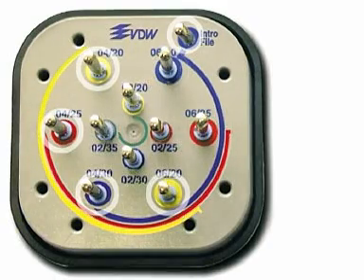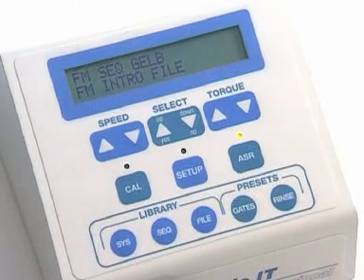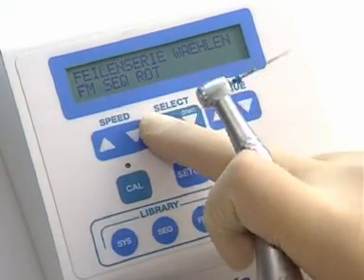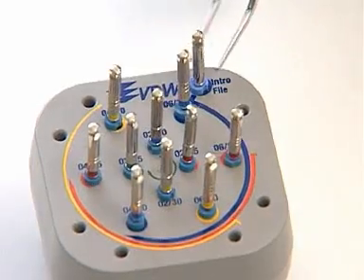Molars have narrow or medium roots. Consequently, the crown-down preparation starts with the yellow or red instrument sequence. For the first canal, the red file sequence and the intro file are selected on the EndoIT Professional. The intro file is always the first file in every sequence.